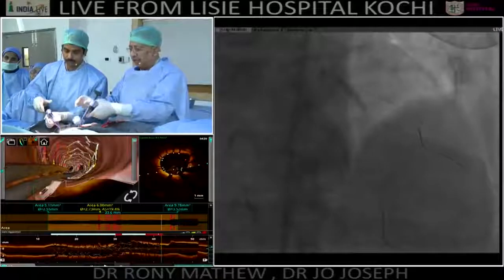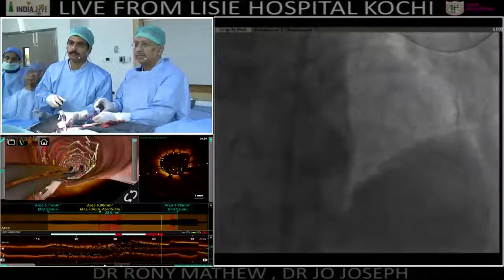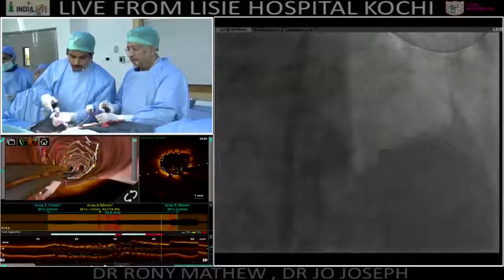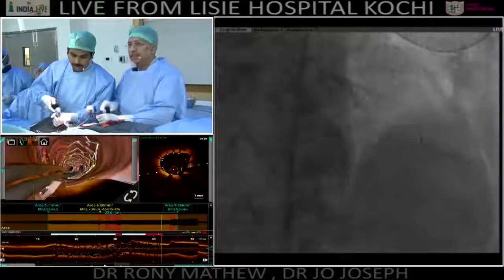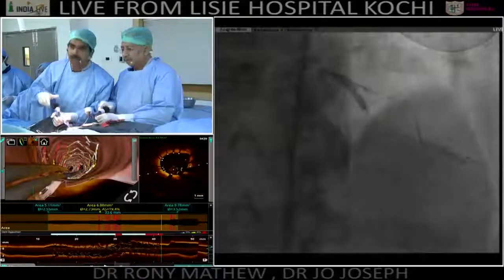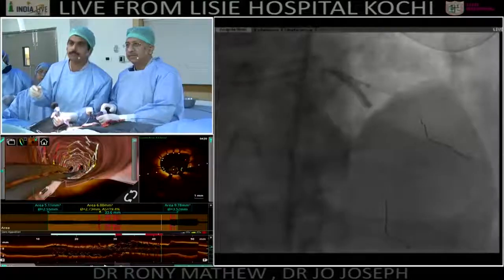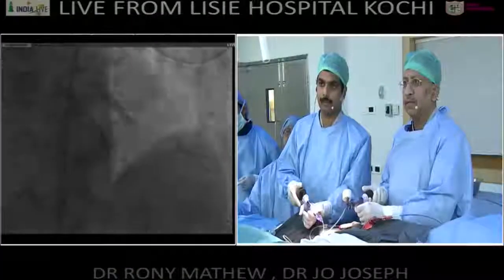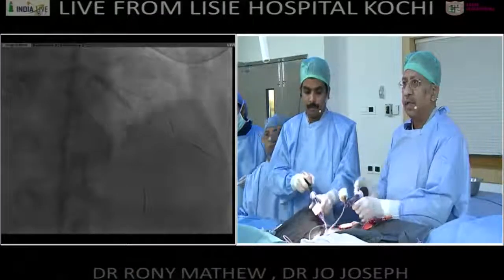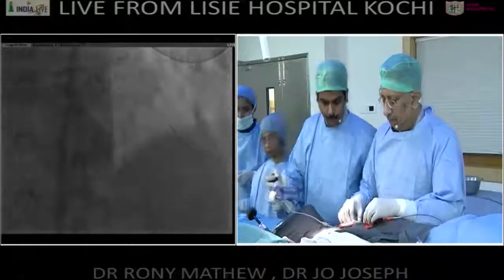Now let's go for the KISS. 2, 4, 6, 8, 10, 12. Go up. You go to 16. 16. Negative. Now give me a 3.5 to do POT before I put the OCT inside.